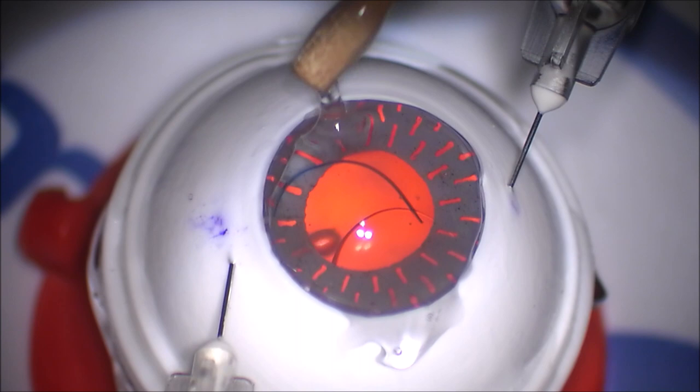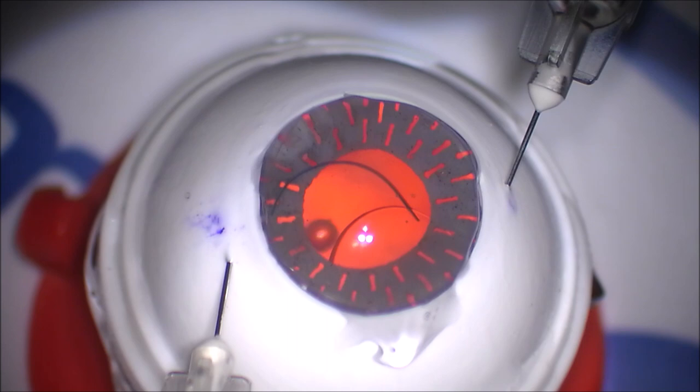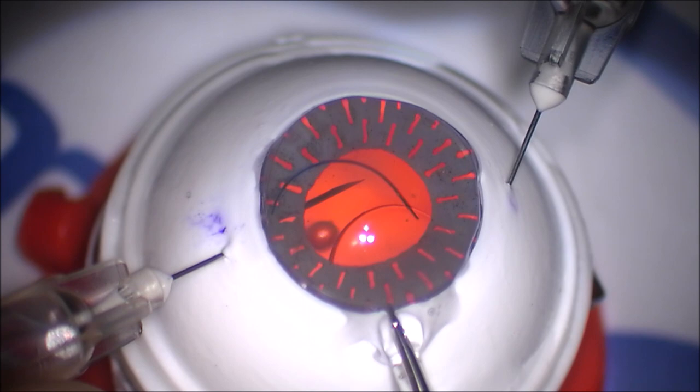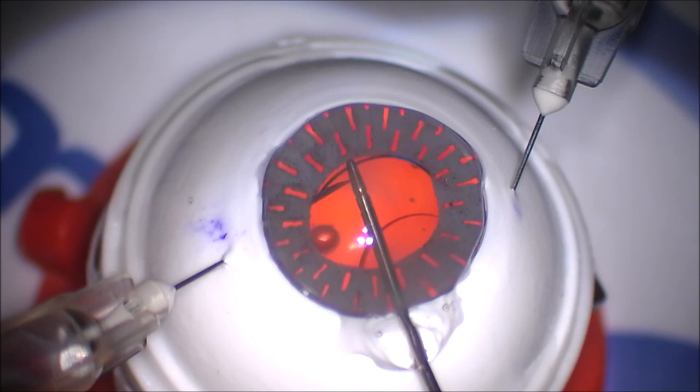And you can see as I pulled both needles out, because the haptic is a little bit bigger than, for example, the CT Lucille lens, it doesn't tend to slip as you're pulling the needle out, and it stayed nice and tight within the lumen of the needle. And so this procedure looks like it would have done very well if this was a real patient.